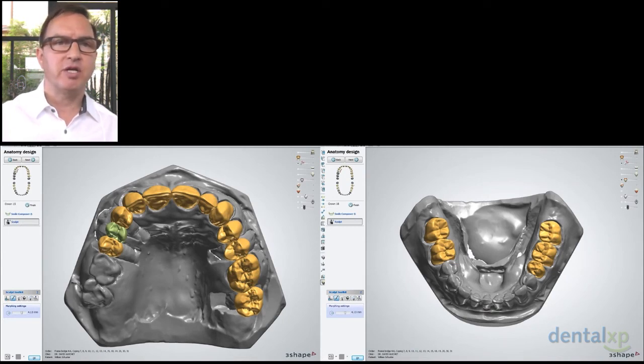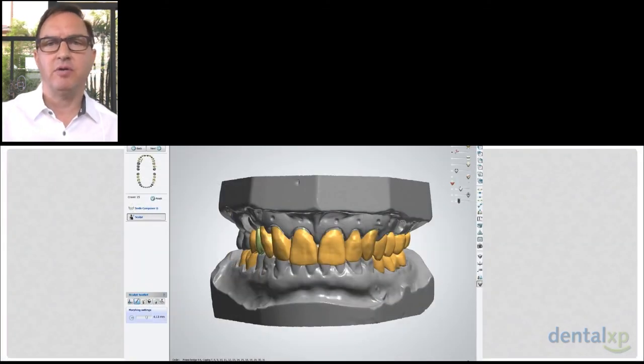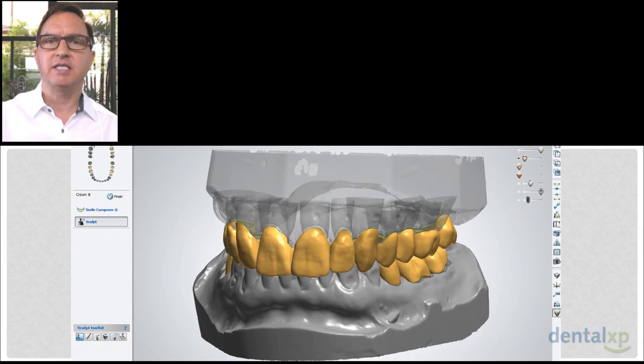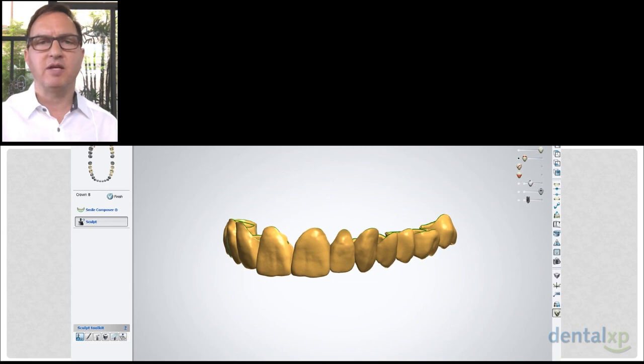This is the image of the 3Shape software with the maxillary and mandibular restorations at full contour prior to cutback. You can see here in this view the transparency will reveal that there are physical dies. These are laboratory models that have been trimmed, with the high-resolution scans mathematically on top of those dies. The computer superimposes a space for a die, identifying the margins in green, the die space in kind of a yellow, and then minimum thickness is imposed for the restoration, so that anywhere we design a restoration that's too thin, the computer will superimpose the required minimum thickness for the safety and strength of the restoration.